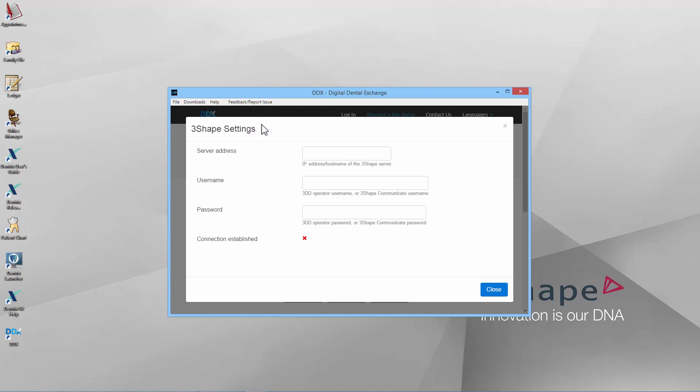You now need to fill in the name of the PC where the 3Shape server is located. Next, fill in your 3Shape Communicate credentials or the name and password for your user profile in Trios.